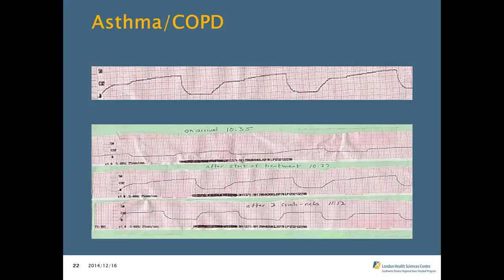Well, that's excellent timing for the question, because our next slide is about asthma, COPD, EndTidal CO2 retainers, people with increased expiratory times. If you notice at the bottom tracings, this is an asthmatic patient. The top waveform is characteristic of a typical asthmatic patient, again, not every single patient. They call this the shark fin capnogram, in that you can see the prolonged expiratory phase and the increased EndTidal CO2 because they're retainers and they're having difficulties expiring because of bronchospasm.